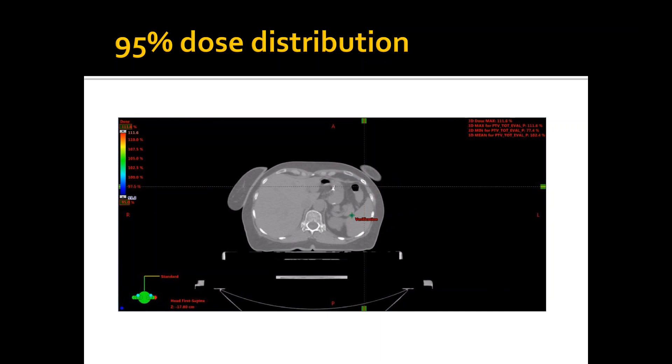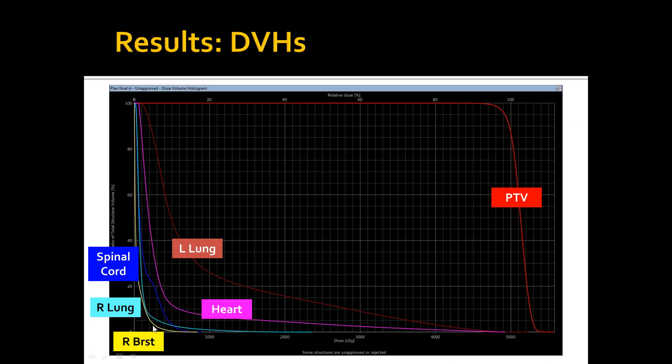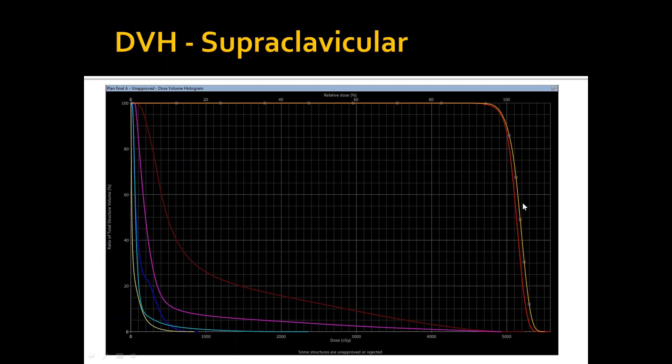This is my DVHs. This is the PTV, left lung, heart, spinal cord, right lung, and right breast. I mentioned earlier that I found some organs at risk easily achieved. This is like the heart for this example, while others like the right breast, it was very difficult for me to achieve good scores there. And just for comparison, this is the supraclav, how it compares with the total target, and this is the left breast, and this is the axilla.